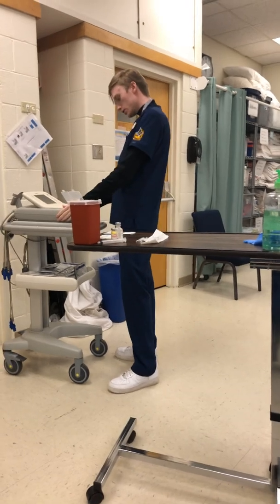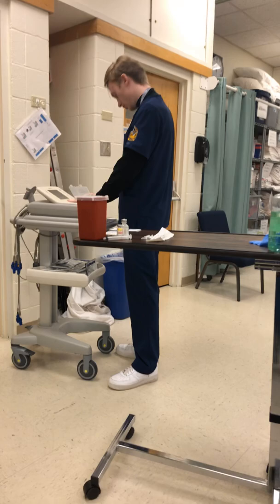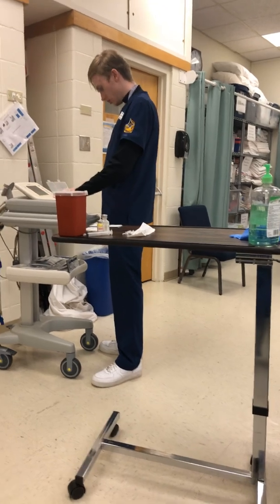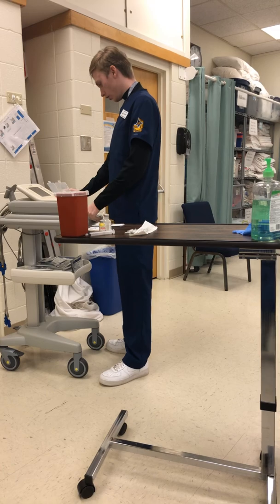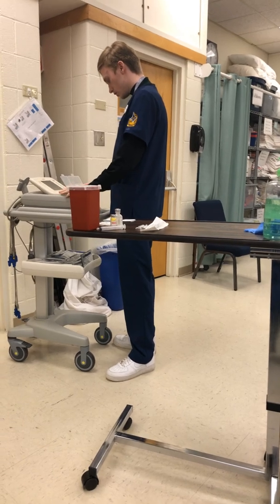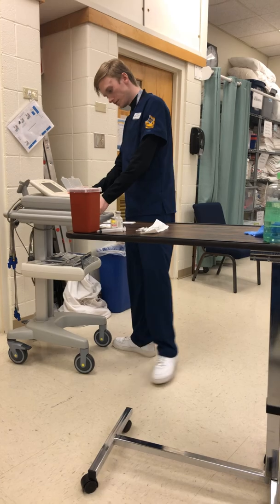And we have to reconstitute and calculate the dosage, but before we do that, I'm going to make sure that we have the right patient, the dose, the time, the route, the drug, and the documentation. And looking at his MAR and the physical copy that we have, looks like everything is correct. Now we have this, we are going to begin reconstituting and calculating the dosage.